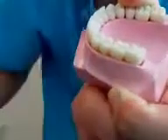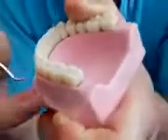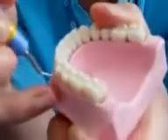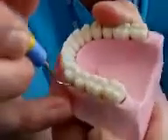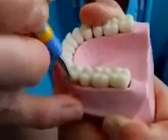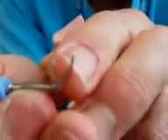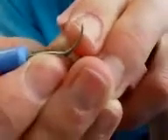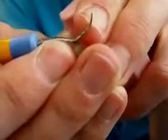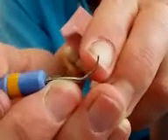You may also choose to come in at a slightly different angle to make cleaning even more thorough — scaling in a slightly different direction. Remember, it's only the tip that's really doing much of the work, so we're talking about just the top few millimetres. That side of the tip has to be covering as much of that root surface as possible.